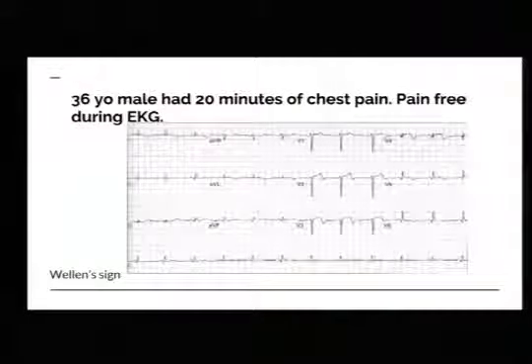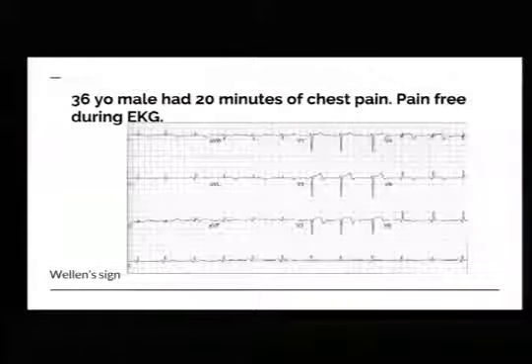So when in doubt, if you can get them, at least come out to the truck and do a 12 lead before you release them would be optimal. Realize not every patient's going to let you. At least document that you tried. So they come back as a cardiac arrest a week later, we can at least say we tried.